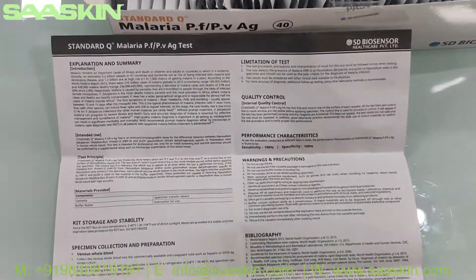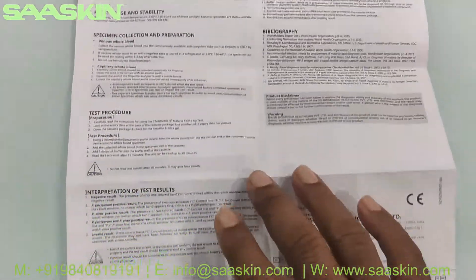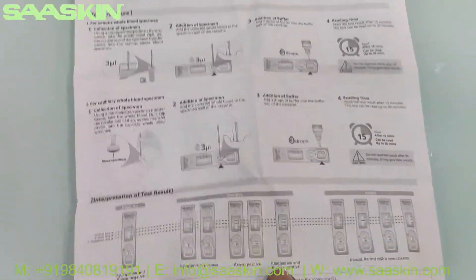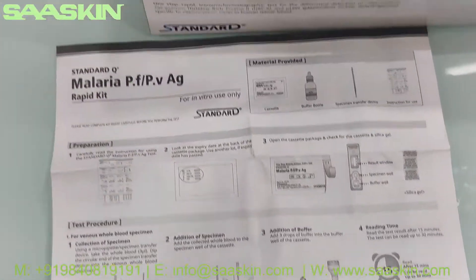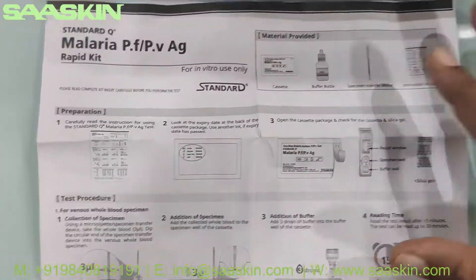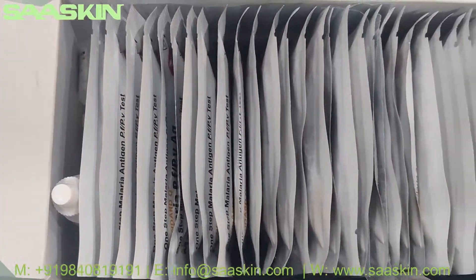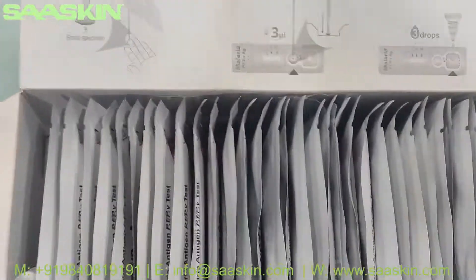This is the other side of the brochure — you can see it's CE-certified. This brochure has the instructions to use. Inside the box you can see the 40 test cassettes.